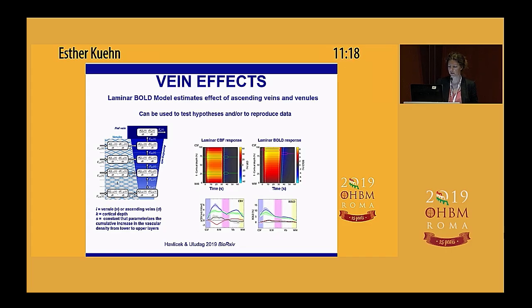So here, for example, this model was used to reproduce the functional activity profile that I showed you on the first slide. This is again the biphasic response that is driven by touch and motor output, as I showed you at the beginning, using CBV and BOLD signals. And this model was actually able to reproduce exactly this biphasic response for the CBV response, but only one peak response for the BOLD response. So it's this kind of modeling technique that you can also use to verify your analysis, but also to derive specific hypotheses of how your experimental paradigm can perhaps drive your real measured data.